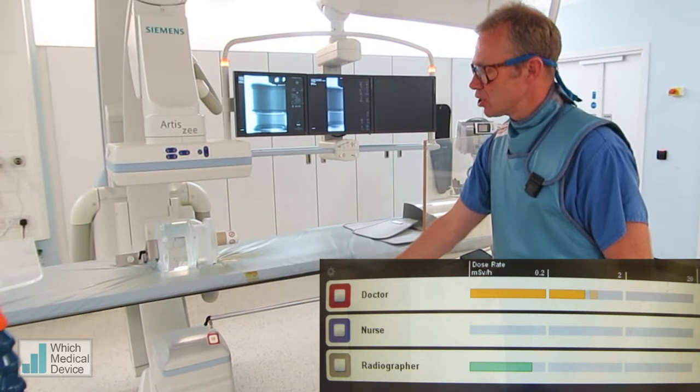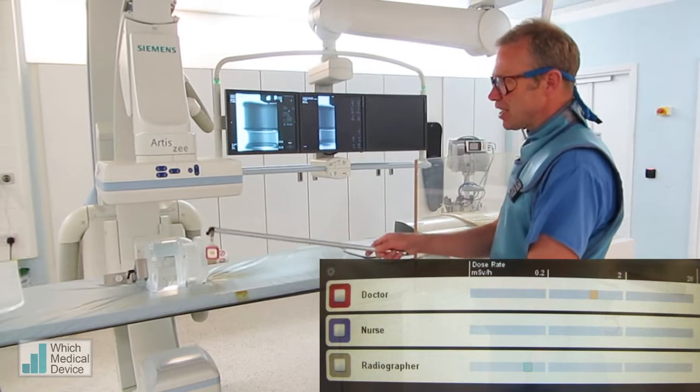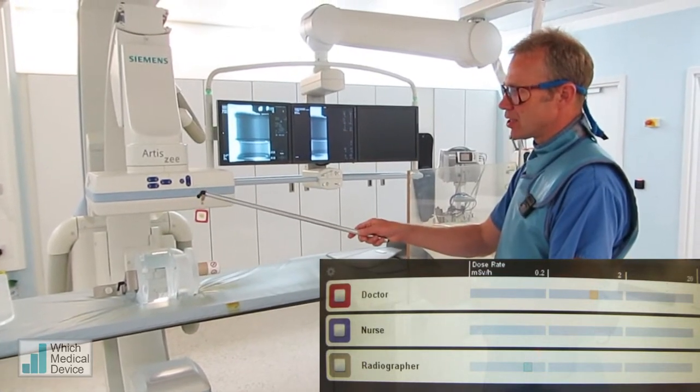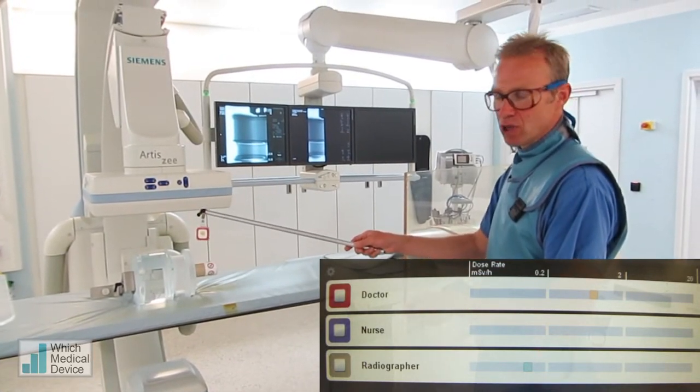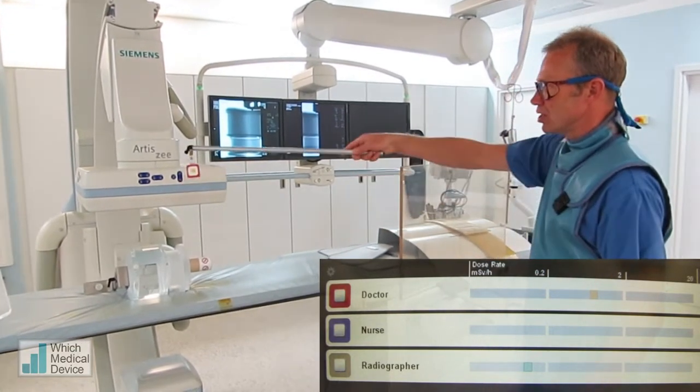Of course there are various things we can do to reduce this dose, which I'm going to show you in just a moment. Now that's just screening — that's fluoroscopy. Now if we do an actual digital subtractive run, taking this at 4 frames a second, just watch what happens to the dose here.